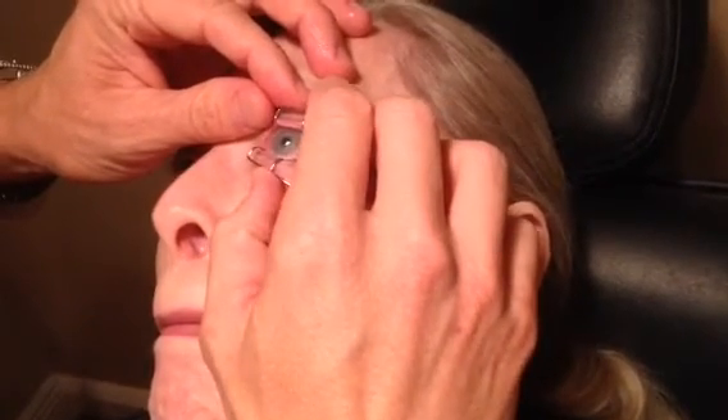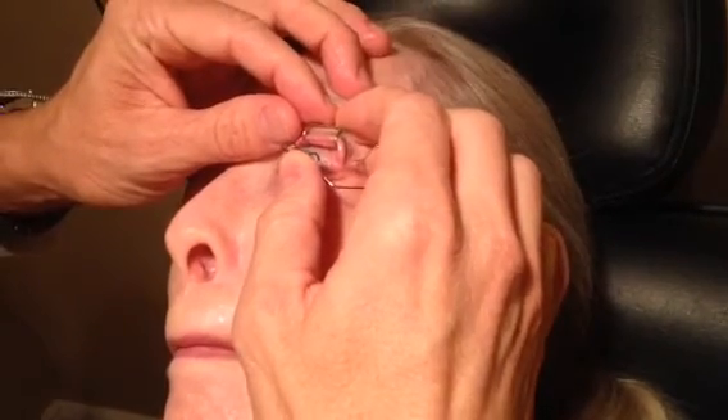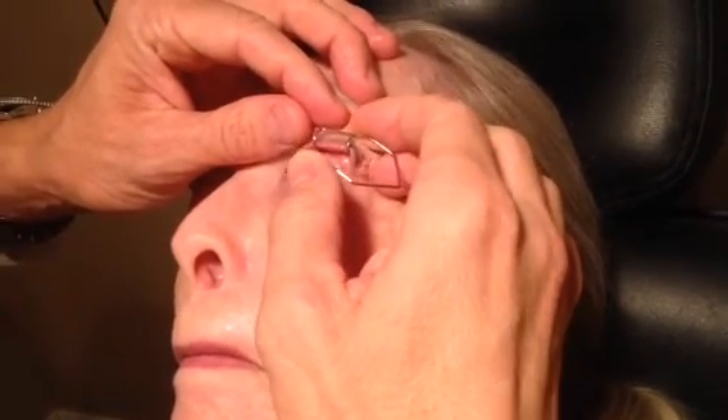Okay, look up a little for me. Good. Hang on. You did it. Is everything still in place? It's still in place. That looks a little here. Good. Good.